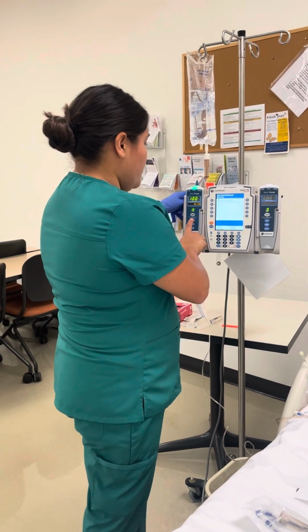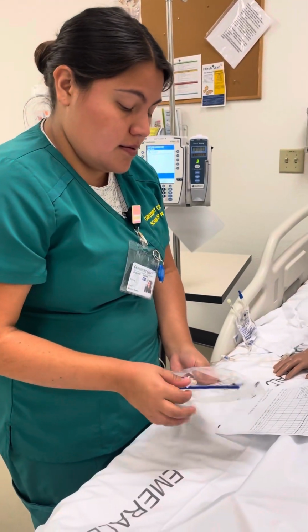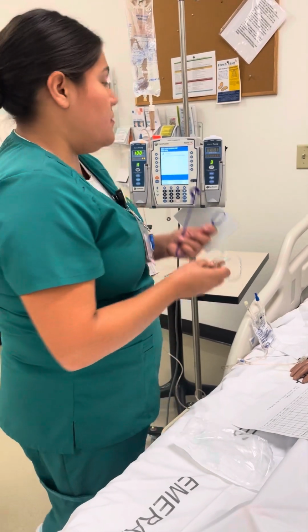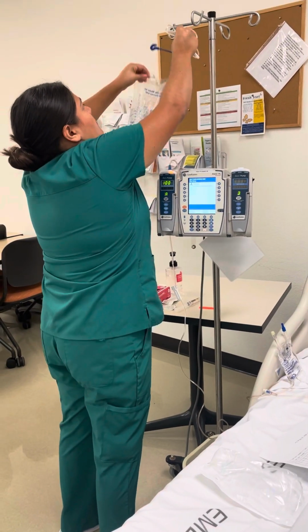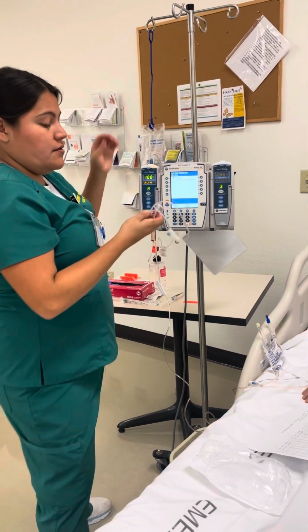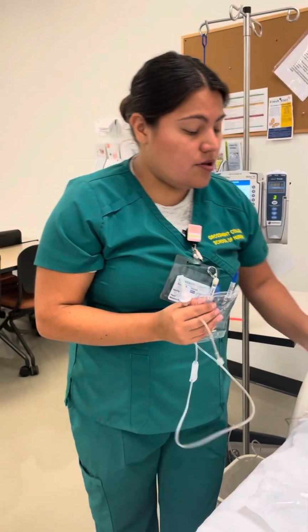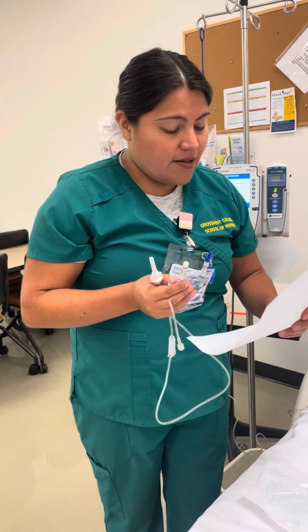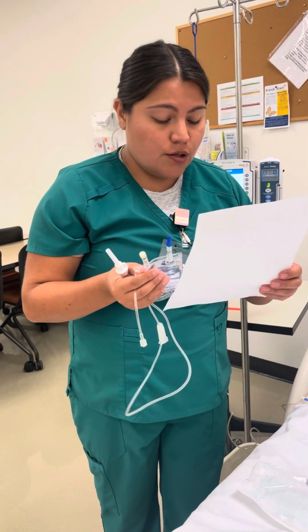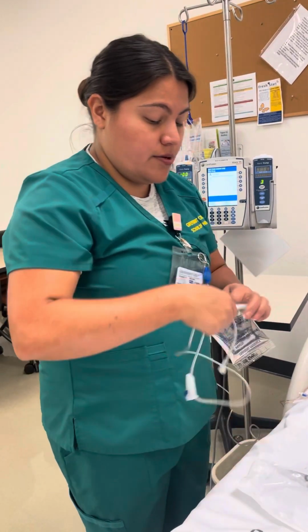And then I will pause. Open my secondary tubing. I will hang this. And I will check again with my MAR that I have cefazolin 2,000 milligrams in 100 ml. It's not expired and it looks good. I'm going to open and spike.